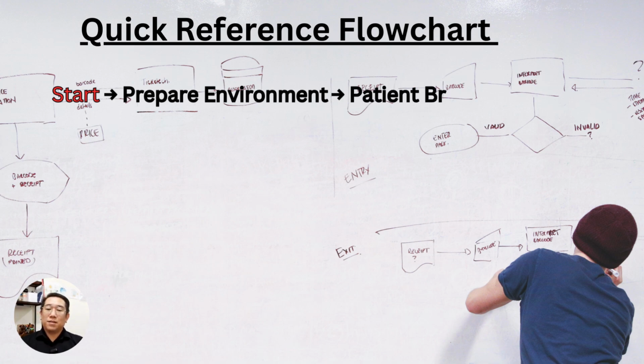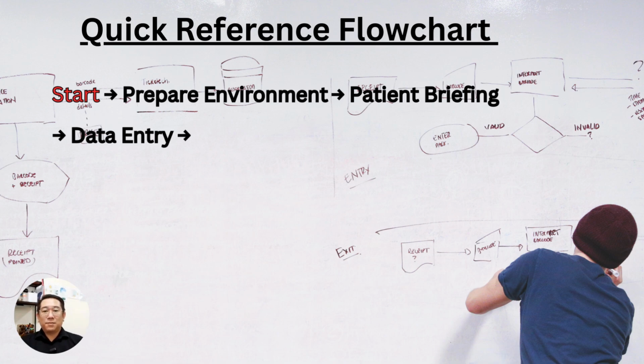Next is the patient briefing. Explain the test and instruct clearly. After that, the data entry. Input the patient's detail and select the test setting. When ready, position the patient. Adjust their chest, chin rest and forehead rest for the patient's comfort and stability.